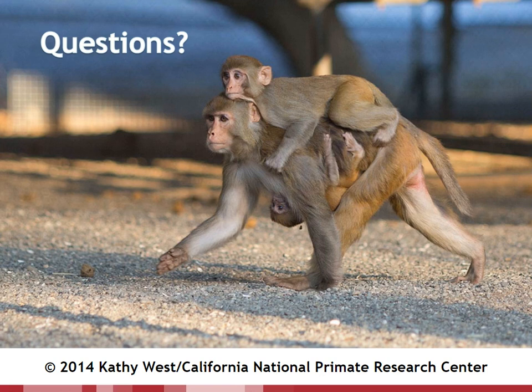Excellent. Thanks, Lais. Question here from Corey, who's asked, has the EEG drug test produced any false positives or negatives? Not until now. We do repeat the baseline recordings and vehicle recordings, and I don't know if I was clear on that on my slide, but vehicles never induce, even an injection right before the recording doesn't really change EEG activity. And what we do need to look at is whether a benzodiazepine type drug that does not have, for example, anti-conflict effects would have the same beta activity increasing effects, because then that would be a false positive. But that is something that we need to look at. But up until now, we haven't seen anything that would indicate a false positive or negative.